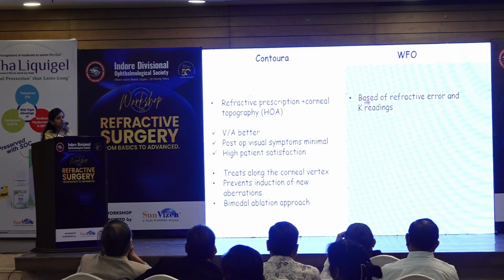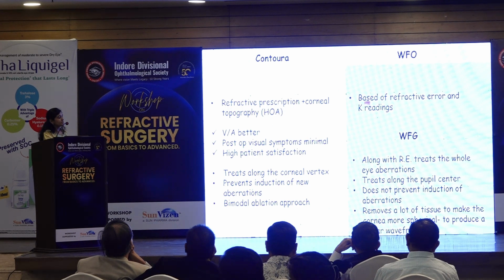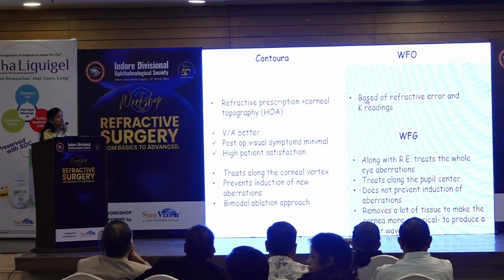WFO treated just the refractive error based on the prescription and the K readings, whereas Contoura, along with refractive error, treated the irregularities and the aberrations of the anterior corneal surface as well. And how is it different from wavefront guided? So wavefront guided treated the ocular aberrations entirely, and Contoura treated just the anterior corneal surface.